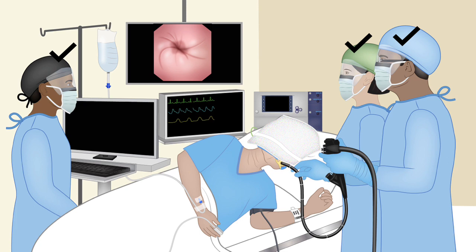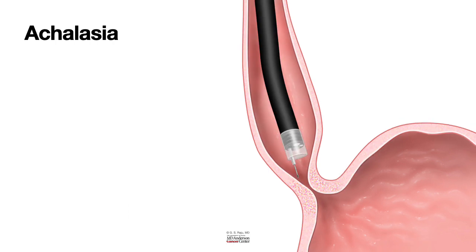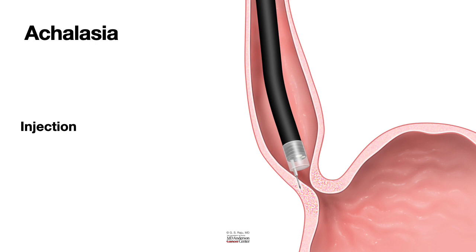Having taken precautions and prepared the solution, we are ready to inject into the lower esophageal sphincter in achalasia. In achalasia, there is spasm of the lower esophageal sphincter that prevents it from opening when we eat, resulting in difficulty swallowing. We get the scope down to the lower esophageal sphincter, get the needle out, and typically use a 23-gauge injection catheter to inject Botox into the sphincter.